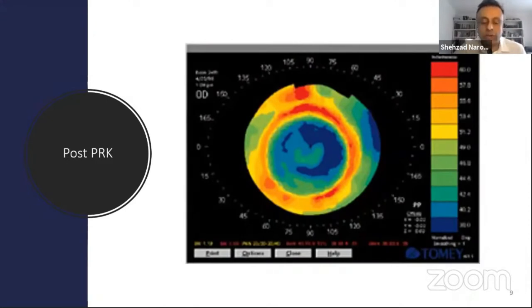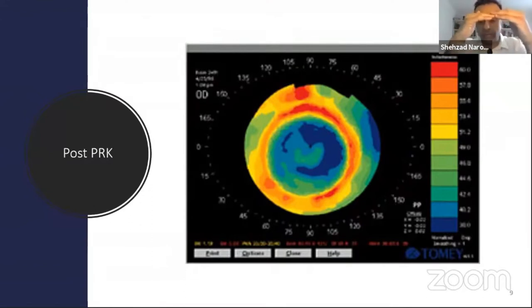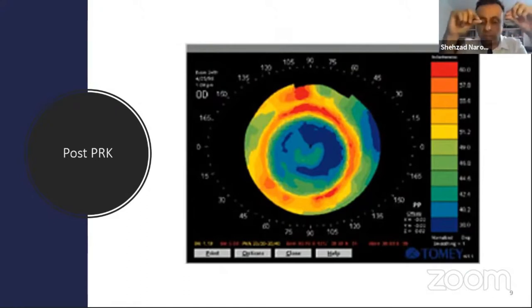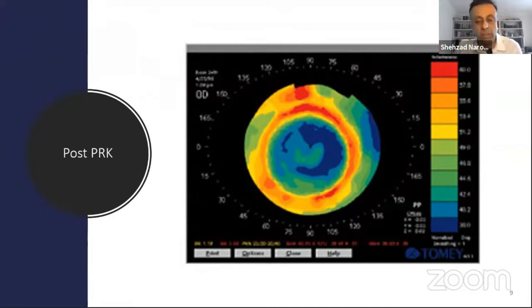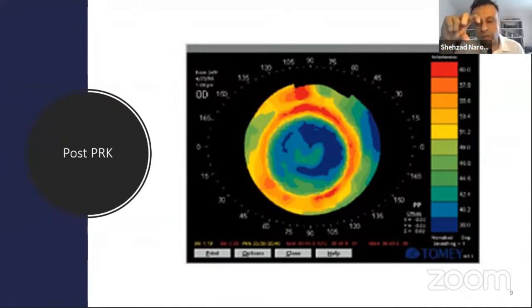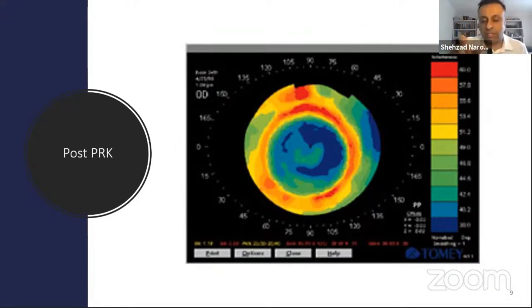This is a post-PRK (photorefractive keratectomy) patient — it could equally be post-orthokeratology, as the appearance is similar. After myopic PRK we ablate and flatten the central corneal tissue, producing mid-peripheral steepening, with the extreme periphery untouched. You can tell this is PRK rather than orthokeratology because the flattened zone is about five or six millimeters in diameter, roughly matching the PRK laser ablation diameter; in orthokeratology the flattened zone is usually slightly smaller.